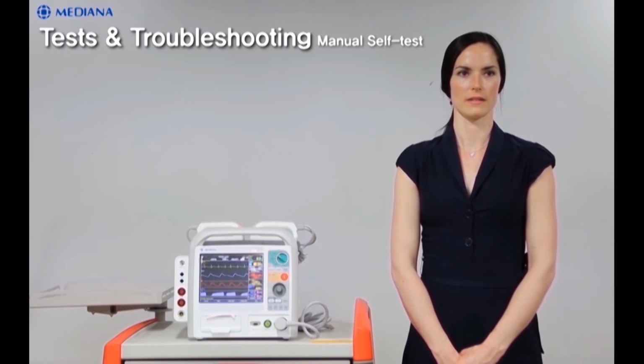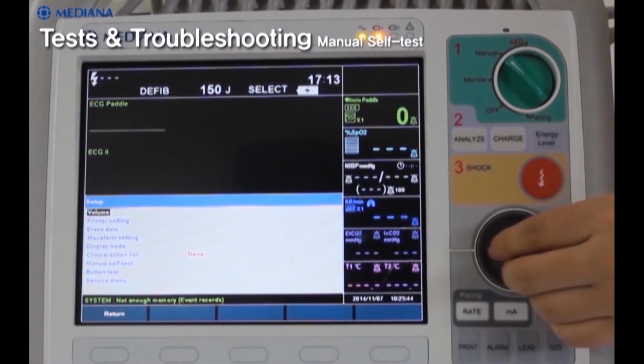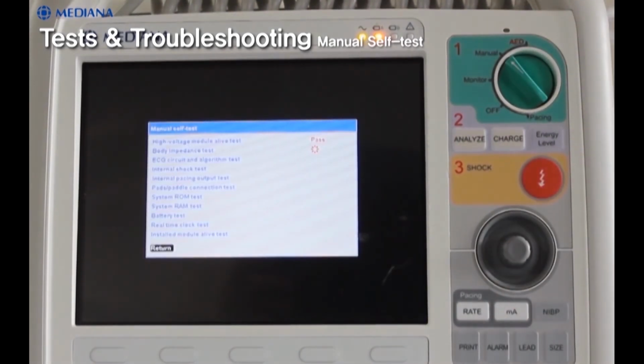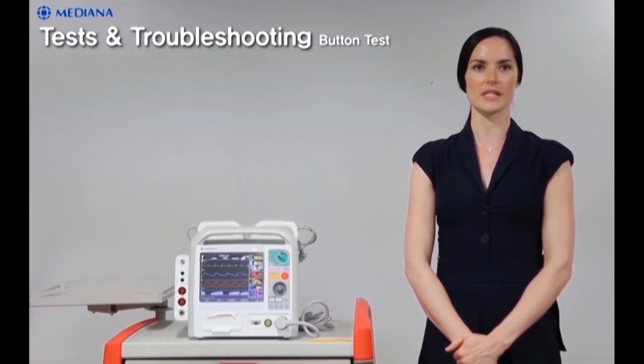Manual self-test. If the user wants to perform a self-test, it can be performed by choosing the manual self-test function in the setup menu. Button test. The user can check whether or not buttons are working correctly. It can be selected with the button test function in the setup menu.